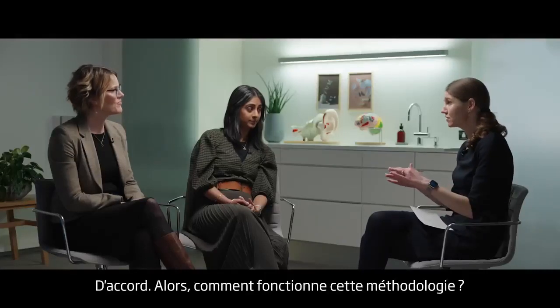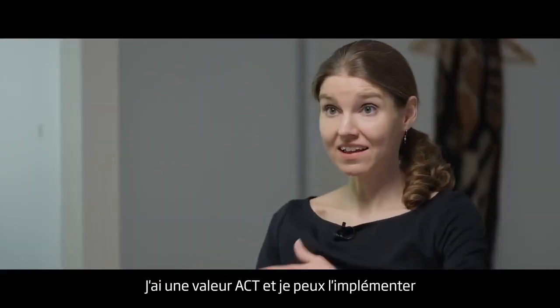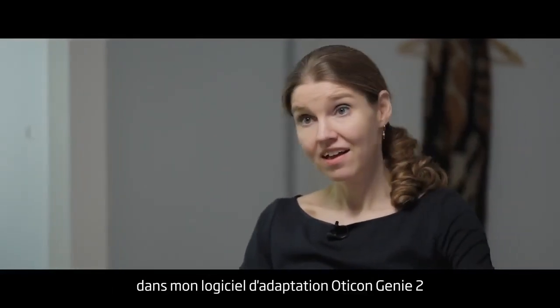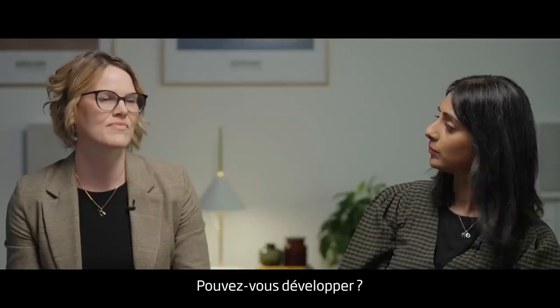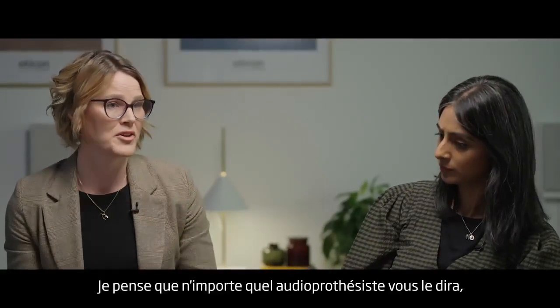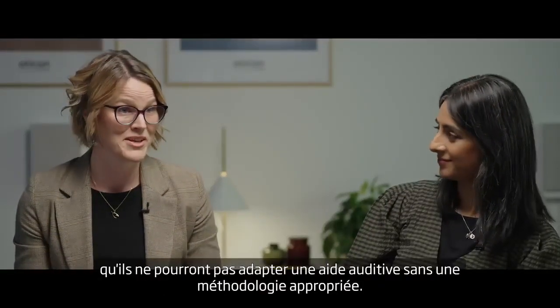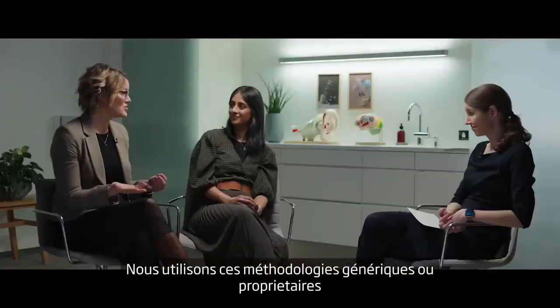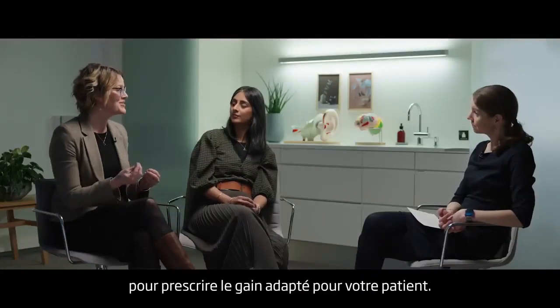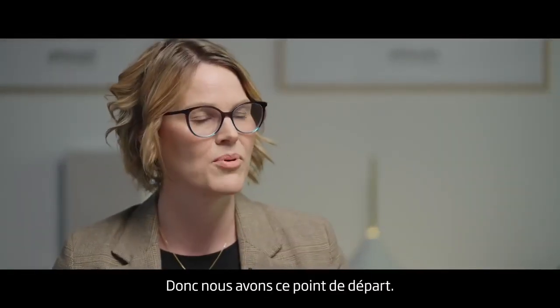Okay, so how does this prescription work? I have an ACT value, and I can implement that into my Oticon Genie 2 fitting software. And what then happens? Can you elaborate a little on that? Well, I think any hearing care professional will tell you that they're not going to fit a hearing aid without a fitting rationale. And we use these either generic or proprietary fitting rationales to set the gain correctly for your client, right? So you have that starting point.